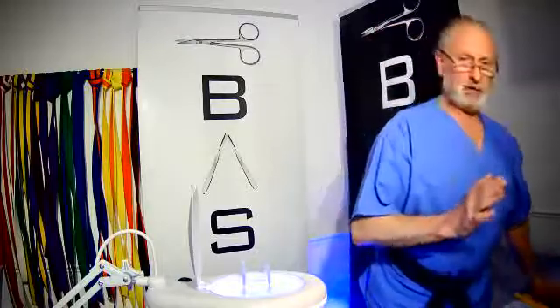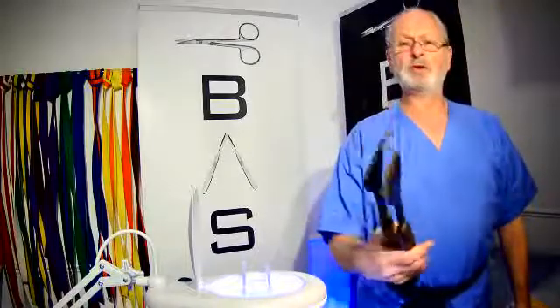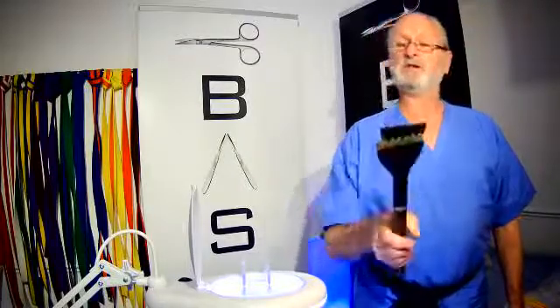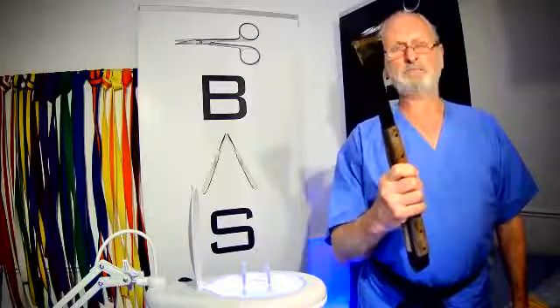Tonight, we're talking about forceps. Yep, these are my barbecue forceps, and they are rather crude with teeth at the end. I hold them in my hand for flipping burgers. I don't want to see forceps held like barbecue forceps.